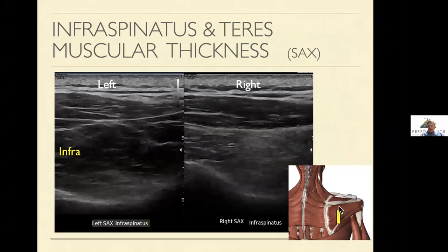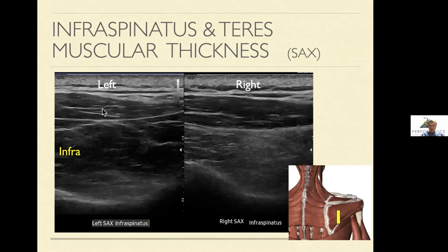Then I look short axis at teres minor and infraspinatus, running from the medial border of the scapula all the way out to the shoulder, looking for atrophy. You can clearly see an asymmetry in terms of the infraspinatus on the right versus the left with fatty infiltration and irregular echo texture. Also look for symmetry in the traps, and get good at finding the same location for measuring muscle size.